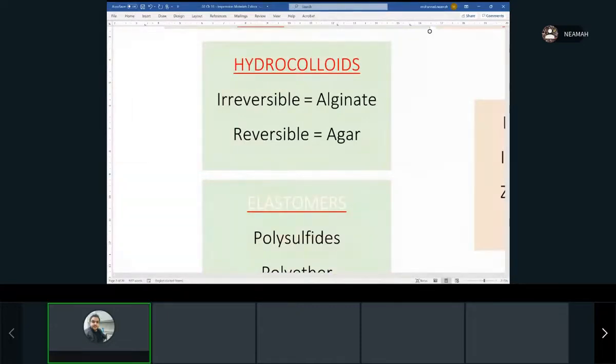It's a good material, and we know it's used for what impression? Primary, right? The preliminary impressions. A fine quality of detail, but it provides us with enough quality to work with to do the things that we want to do.